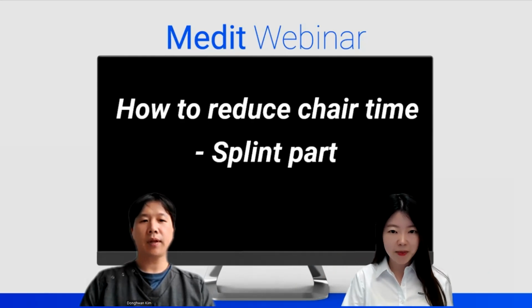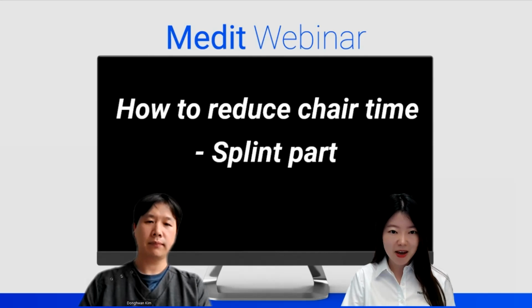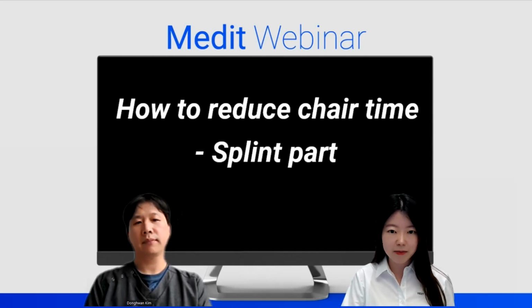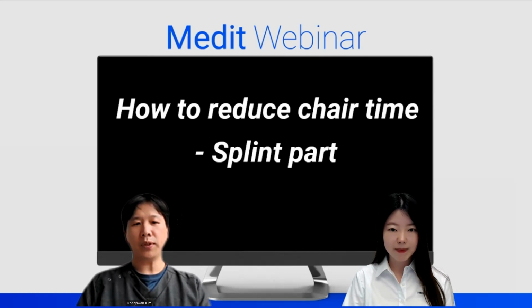So many of you might remember the Hughes webinar series about how to reduce chair time. It consisted of 5 parts and it was a big hit. Thank you for sharing all your tips and common errors that can easily occur in daily practice. As most daily practices have been replaced by digital methods, every work process has become much simpler, but needs caution at certain points.